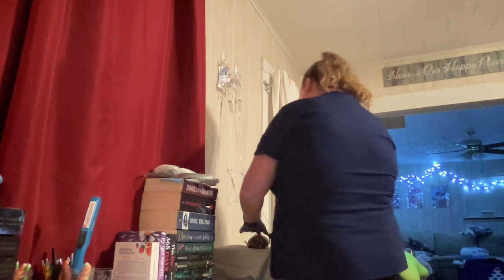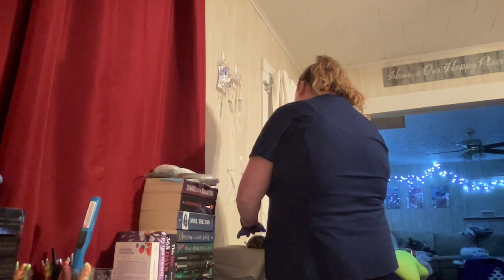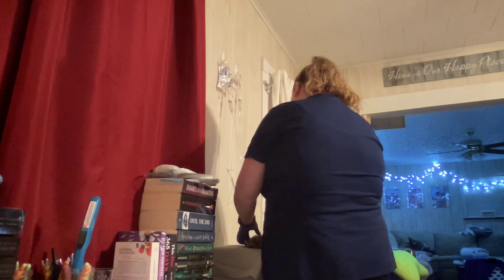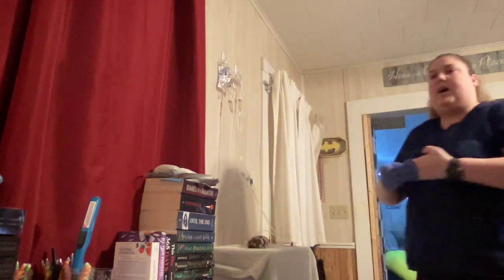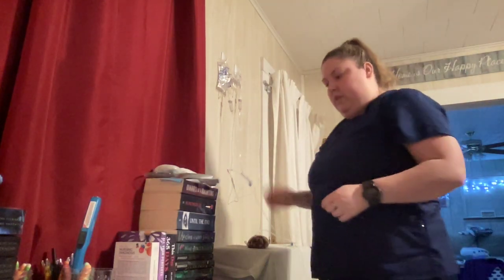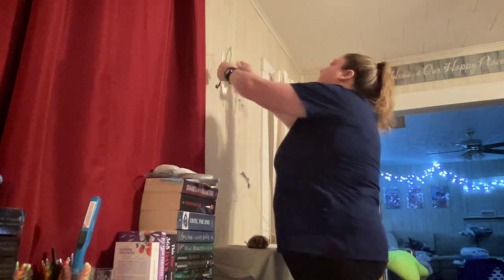I want to check my site again before starting a new medication. No redness or soreness. Ellen, do you have any pain or any questions about the med? No, that's great. I will take my gloves off. And I will clean my hands again. I have already clamped my primary tubing. And I'm going to hang it lower now before I set the drip rate.